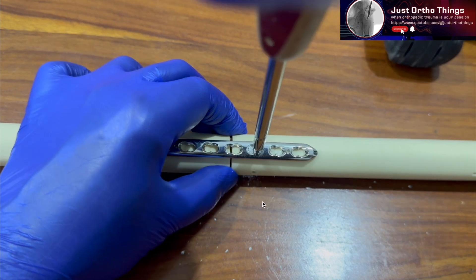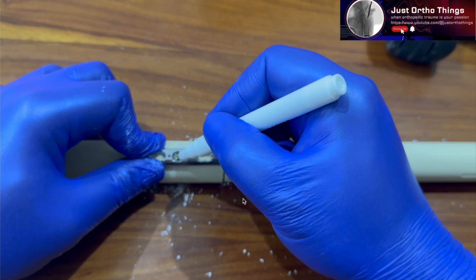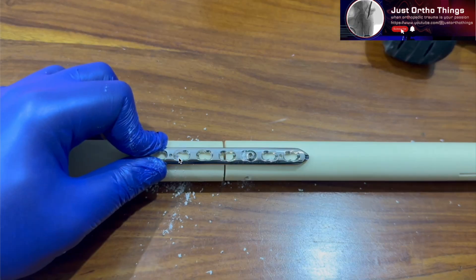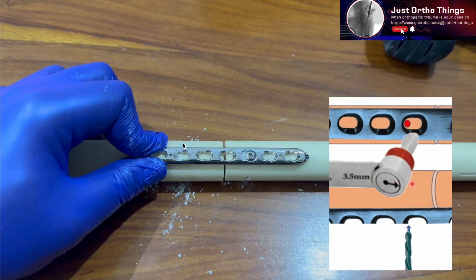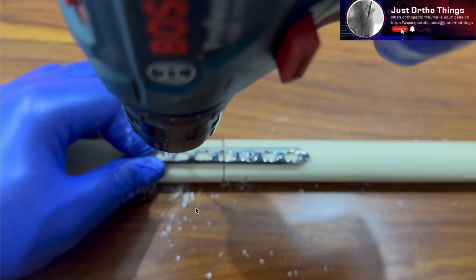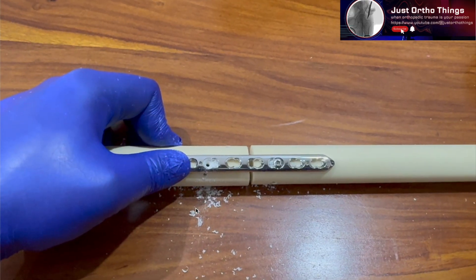The gap still persists and will remain unless we do something. Since we are planning for 2 millimeters of compression, we need to place two cortical screws on the eccentric side — but it is not straightforward. The first screw has to be placed using the eccentric mode of the drill sleeve, with the arrow pointing towards the fracture direction so the sleeve centers in the eccentric position. Ultimately, you drill near the edge of the plate hole — very close to the metallic edge.